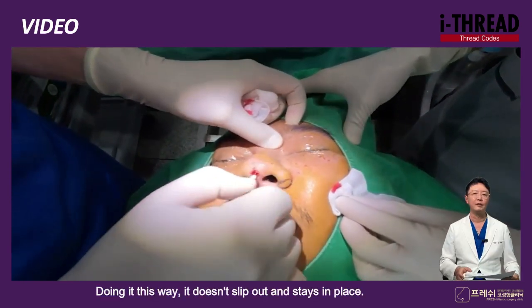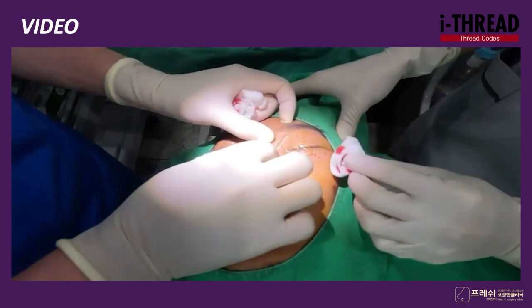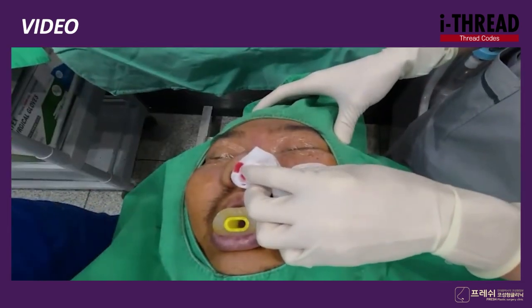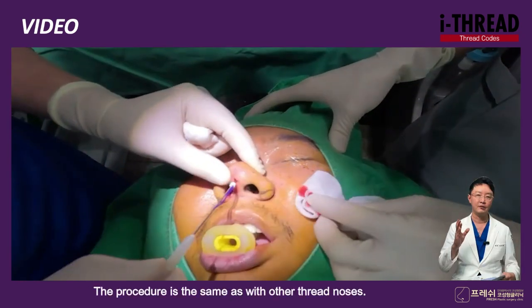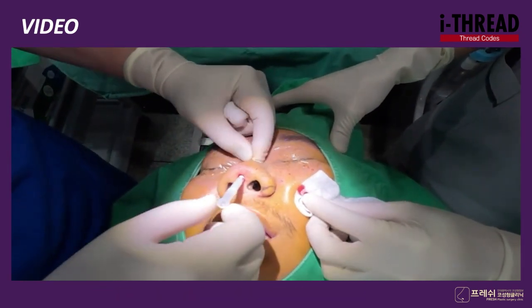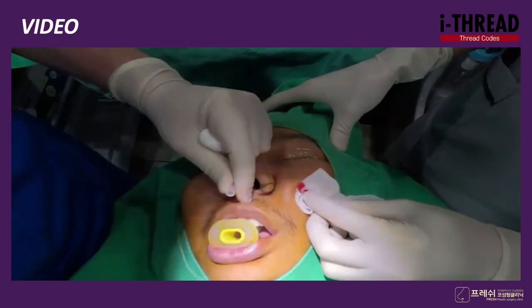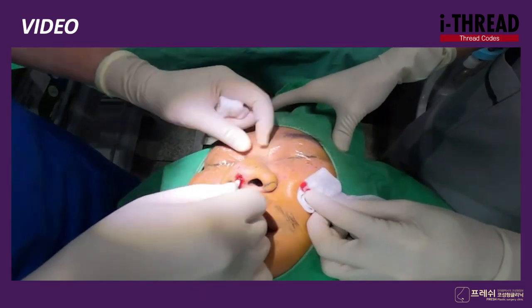Doing it this way, it doesn't slip out and stays in place. The procedure is the same as with other thread noses. I inserted about 4 threads.